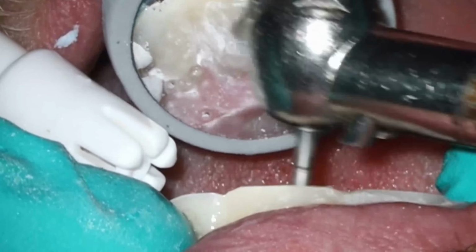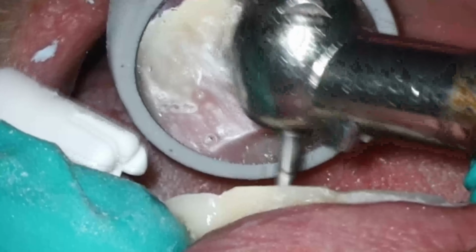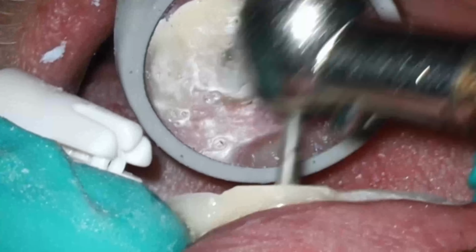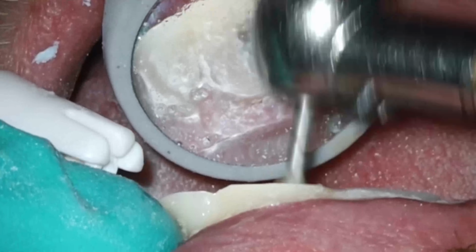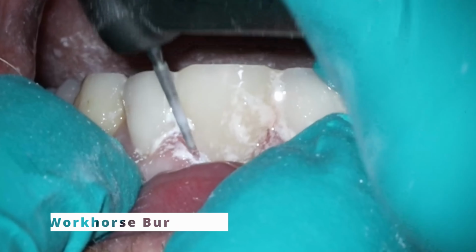As far as the rest of it, pretty much all we're doing here is just finishing up the polishing. I'm not going to go into the full polish on this one like I would if you've seen any of my BioClear ones. The reason being, this has to last a week. So as long as it looks okay, let's go for that.